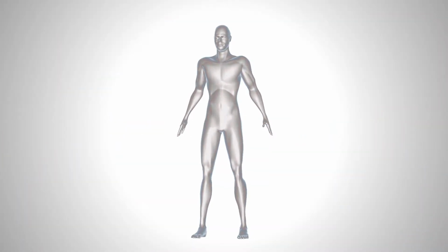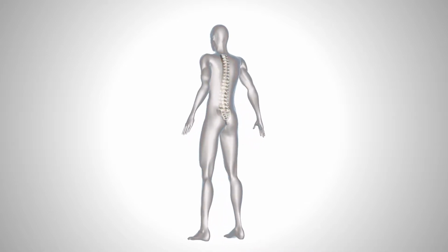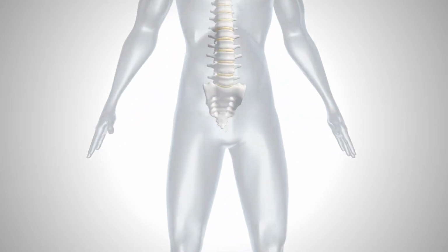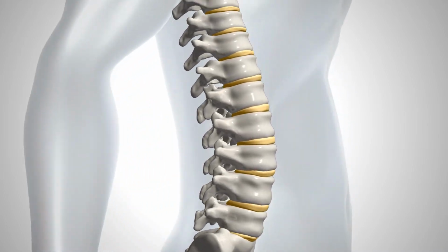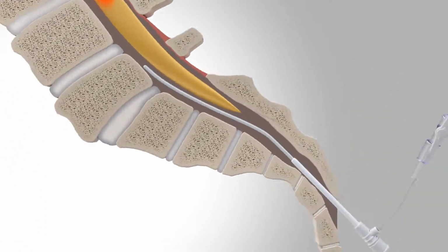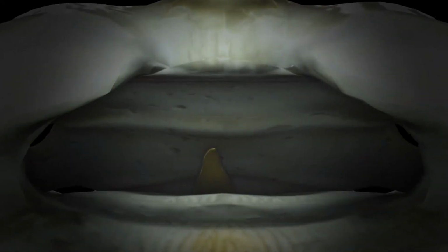It is one of the frequently asked questions about SELD. Imagining our body in 3D brings you to the right way for a successful SELD. There are a few surgeons who insist on the ventral trajectory, which makes it time-consuming for nothing. It is because such surgeons tend to imagine our body structure in 2D of AP and lateral, not in 3D. When the approach of the catheter is mentioned, to say the approach to the target point is more reasonable than to say ventral or dorsal approach. It is important to get to the correct target point, not ventral or dorsal approach.